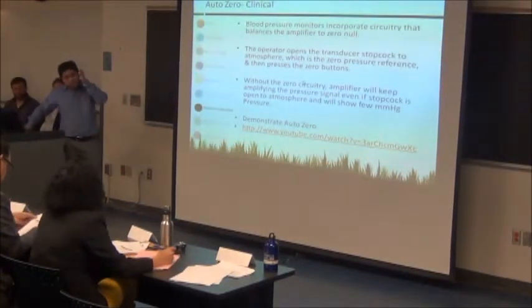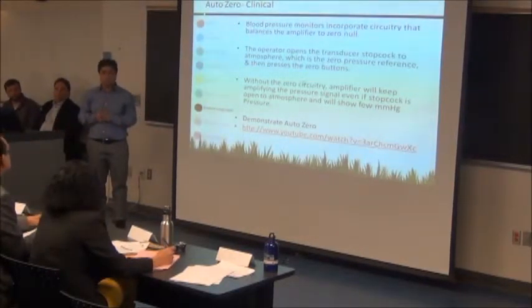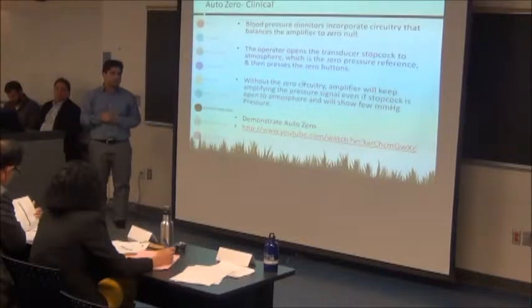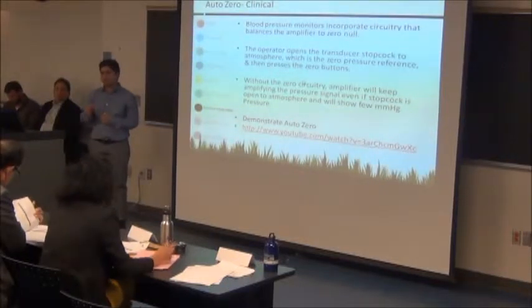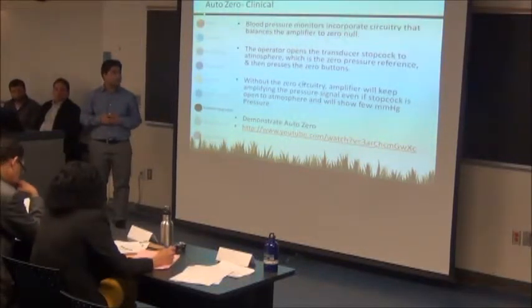So instead of a manual zero, we are using a push button auto zero, which does the zeroing automatically with just a push button, instead of controlling the zero from the pot. So why is it important clinically?